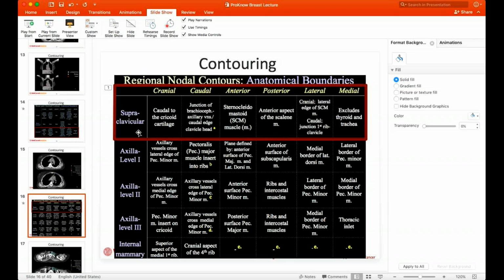I find that sometimes people start too high, and that can cause side effects when it comes to the esophagus, because breast cancer patients do sometimes get problems with pain with swallowing because the lymph nodes are near that region. So you want to minimize that toxicity.